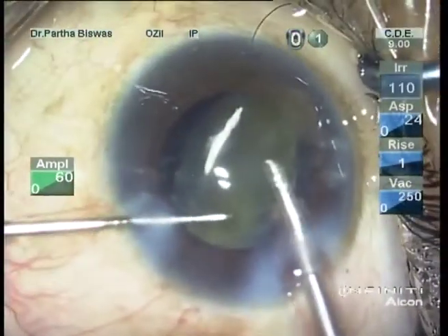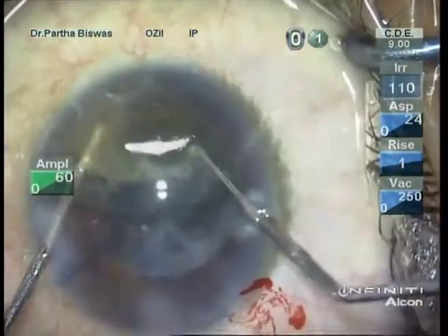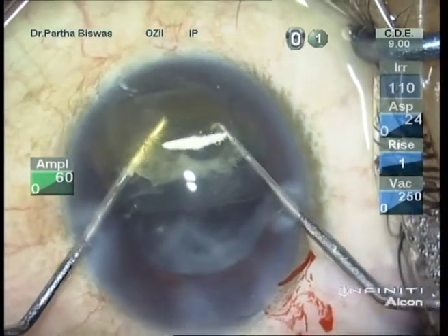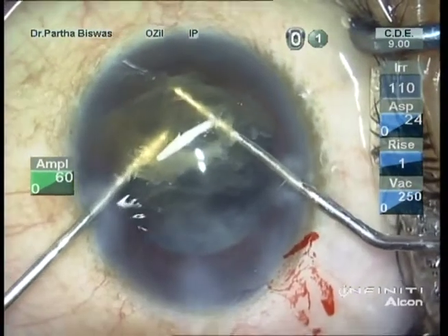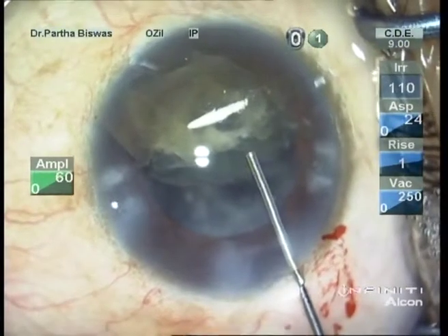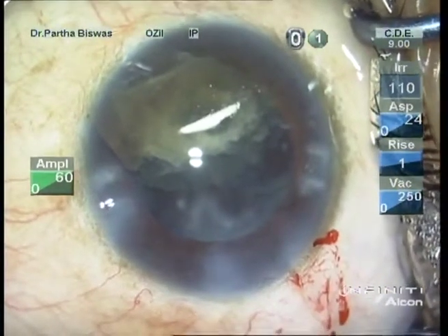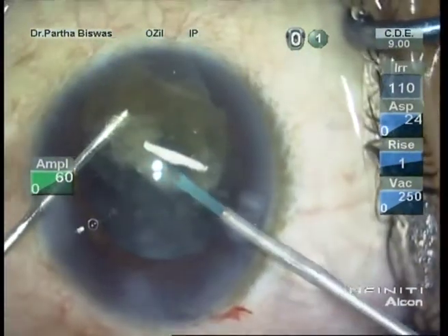The nucleus fragment harboring the implant is tackled last. It is finally turned on its belly, and we find that the implant is posteriorly placed. The implant is viscodissected and then separated from the main bulk by two blunt instruments. But it still stays anchored to the nucleus fragment. We are aware that this implant is very fragile and can break down on any direct impact.